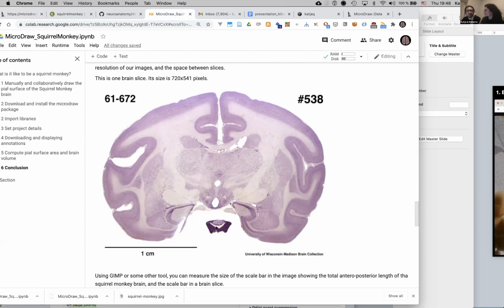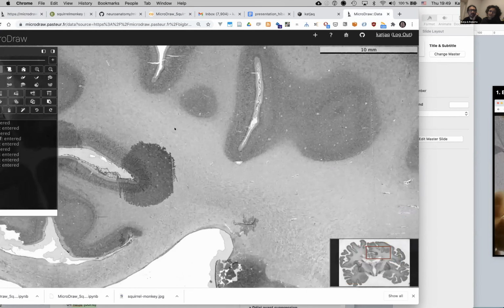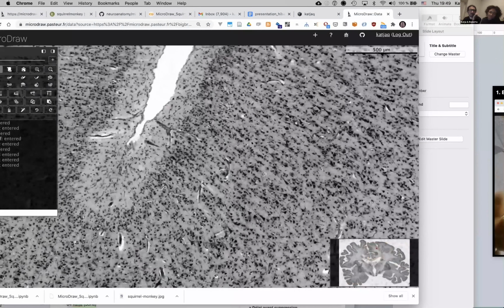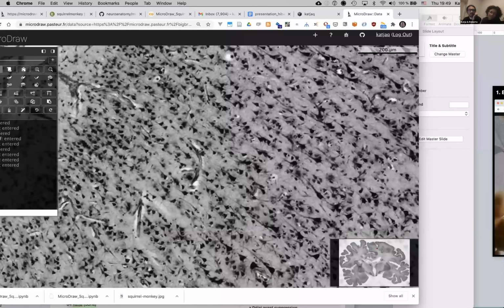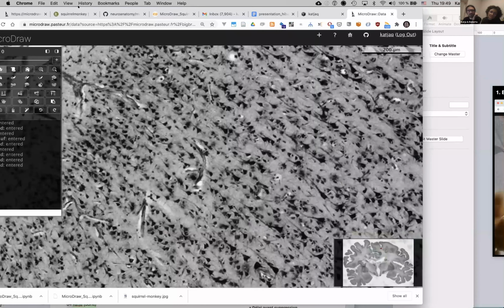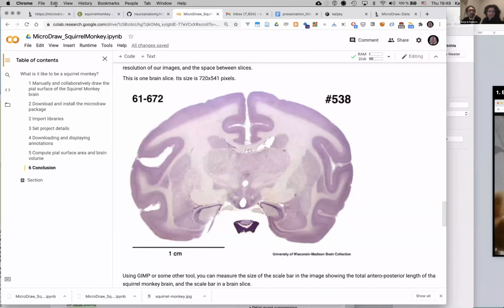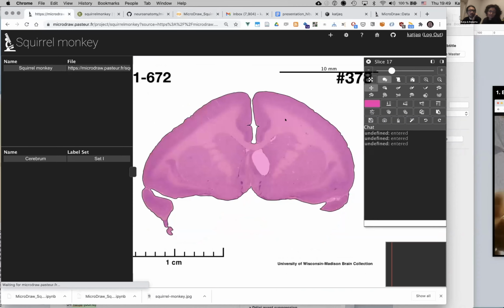Depending on the resolution, a slice of just a couple of thousand pixels should be enough for gray levels, but maybe not for getting to the shape of the cells. If you wanted to look at the shape of cells in different parts of the brain, you would need to take either samples or the whole slices at higher resolution. But just for the vectorial annotation, you don't need to install anything at all. Only probably Google Chrome instead of Explorer.